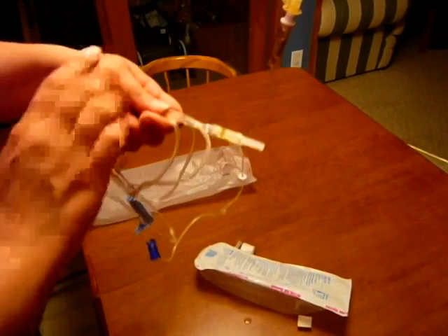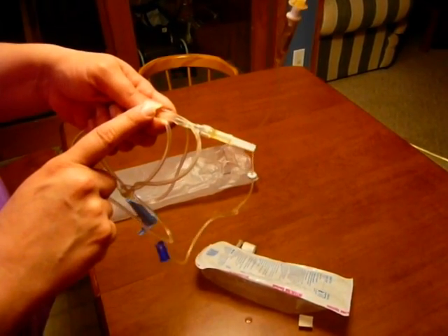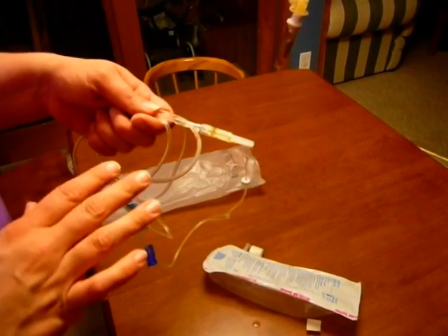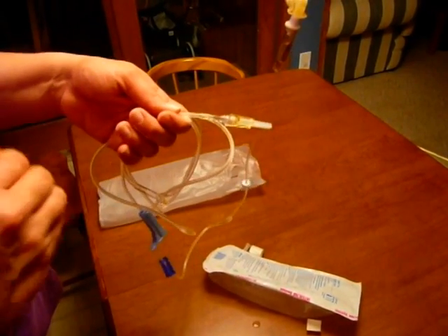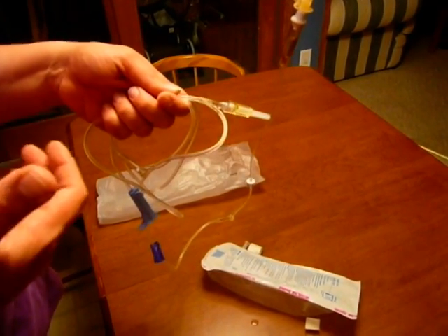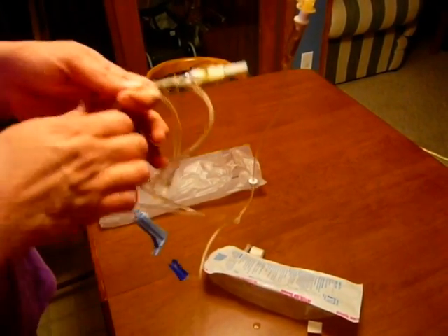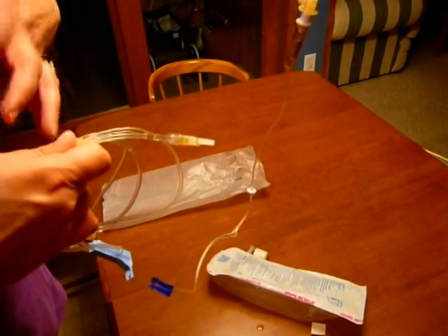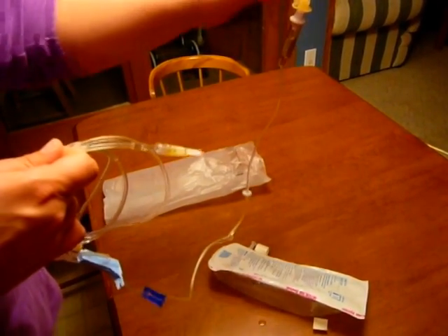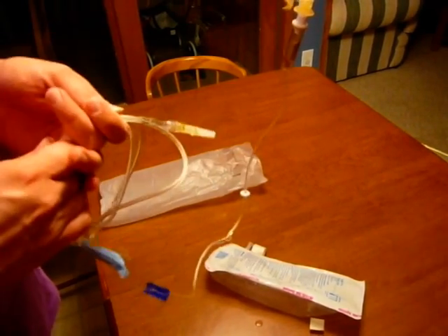If you do see air bubbles, you may have up to one inch of air bubble in the tubing as a whole — but the goal is to get zero. If we have more than an inch, it poses a risk for our patients with air emboli, and that's why we worry about that. Once we have this ready to go, I'm now ready to transition to getting it to my patient. And this is the end of priming an IV bag.